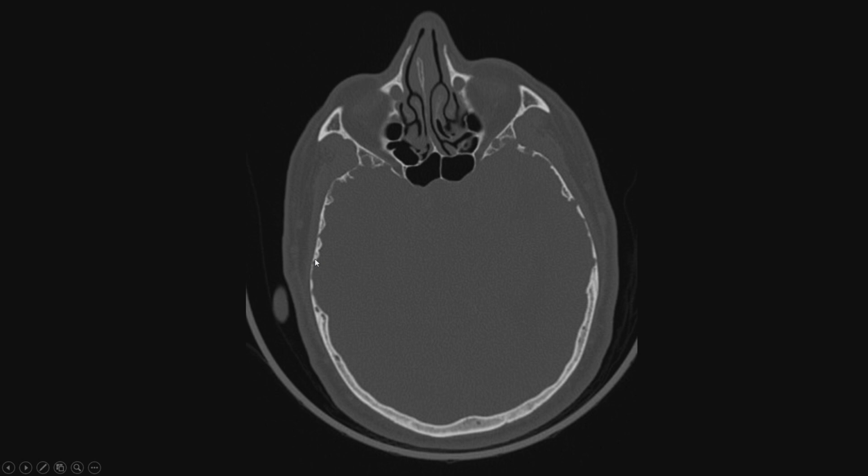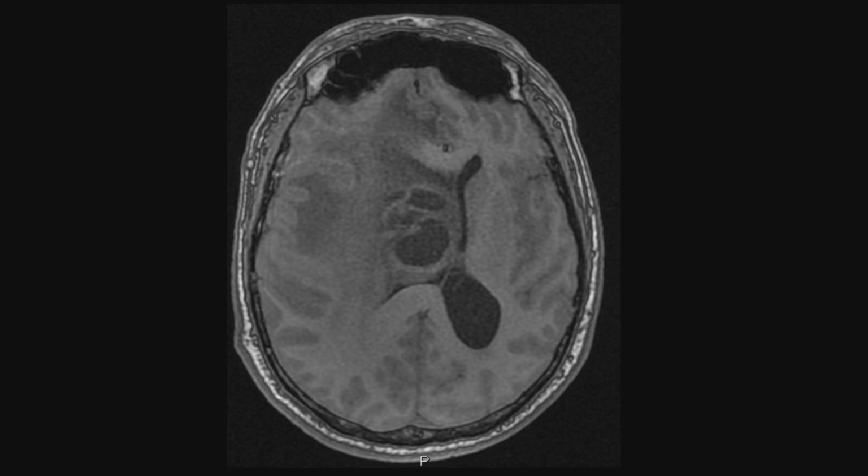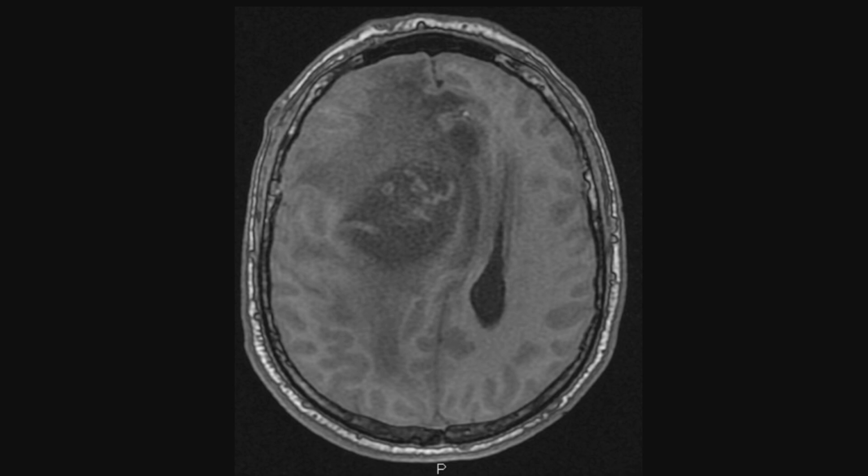Well, contrast magnetic resonance was performed for a greater characterization of the lesion on November 11th. In this sequence, T1 without contrast, we can observe decrease in the amplitude of the subarachnoid space that we already saw in the CT, which corresponds to edema with deviation and compression of the ventricular system. We corroborate the cystic image visualized in the tomography. And we observe a hyperintense serpiginous image that possibly corresponds to vascular structures and the edema that causes deviation from the midline and ventricular compression.